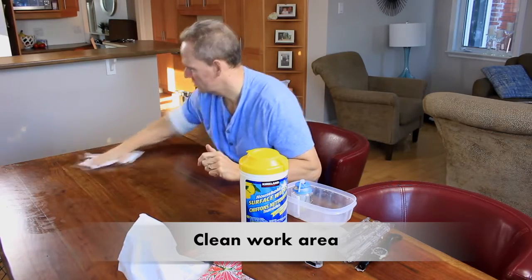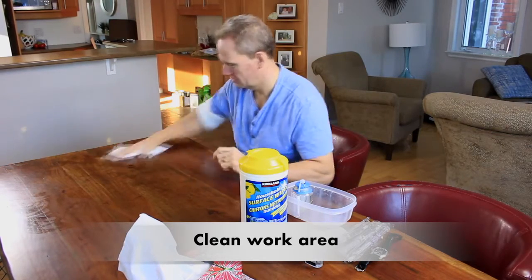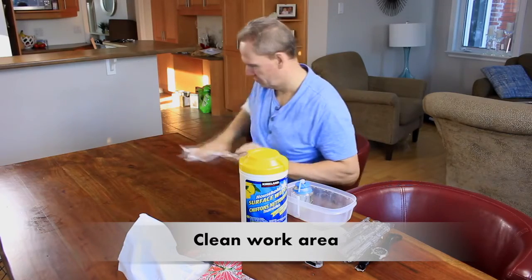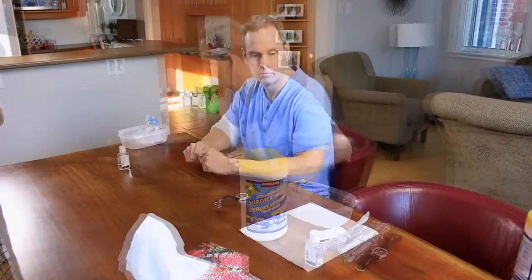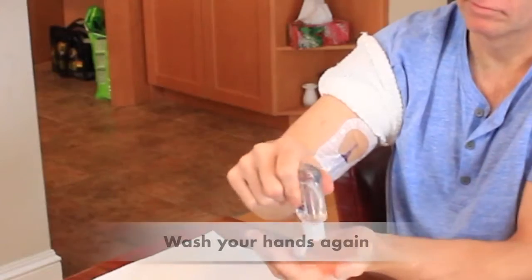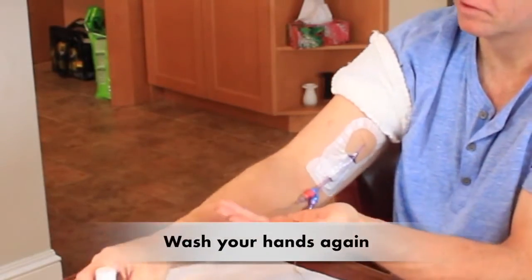You can either wash it with soap and water and a clean cloth or a disinfectant wipe, as Scott is doing here. Or you could use a clean paper towel for your work surface, especially if you can't clean the area. Once you've cleaned your table, you need to wash your hands.